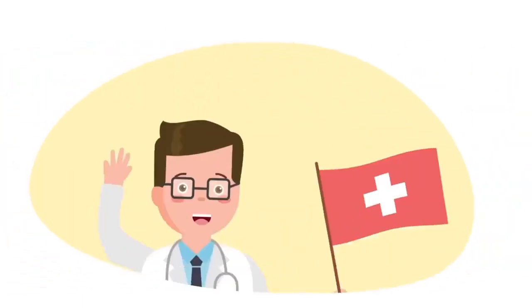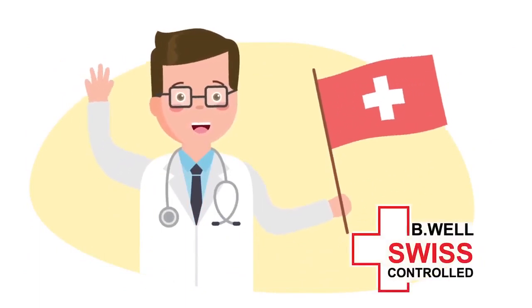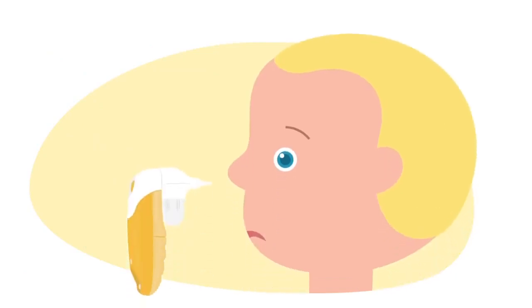The BeWell Nose Aspirator developed by Swiss experts will clean the little nose. The device will help to deal with a runny nose, preserve health, and avoid complications.